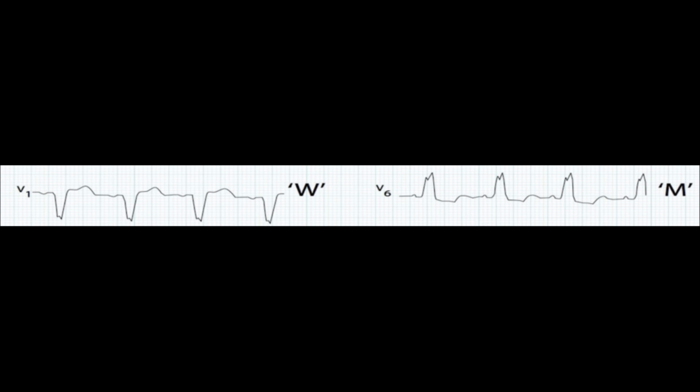If it's prolonged, which again you can rely on the calculated measurement of the EKG itself. Just remember, interpret your own EKGs, don't read the interpretation, but it's okay to look at the measured values of each interval. So if we have a longer duration, greater than 0.12 seconds, then we have to think this is prolonged.